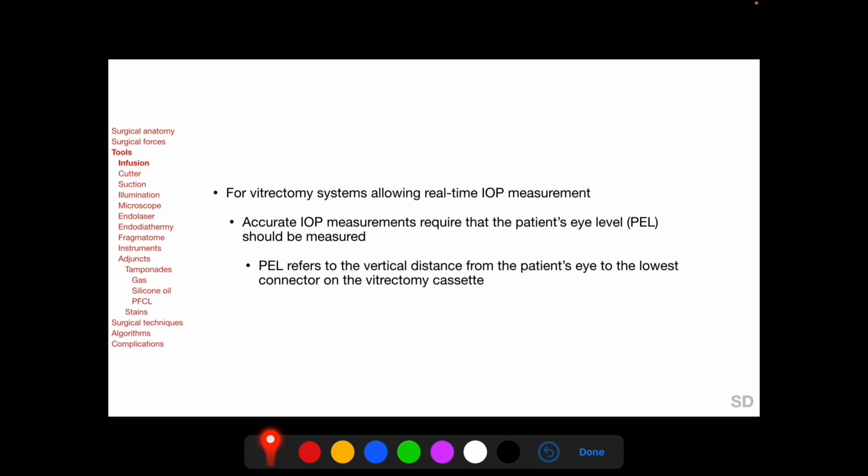In proportional vitrectomy systems, usually suction is linearly controlled by the treadle of the foot switch, with the more the treadle of the foot switch is depressed vertically, the higher the suction attained, while the cut rate remains unchanged. In dual linear vitrectomy systems, both cut rate and suction can be controlled linearly and independently, with vertical movement of the treadle, called pitch, usually controlling cutting speed, and horizontal movement of the treadle, called yaw, usually controlling suction level.